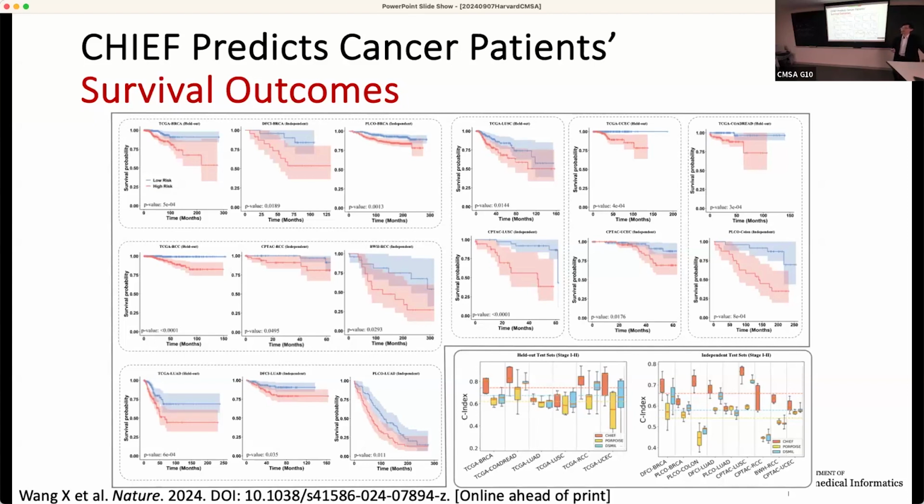That's another good point. In our paper, we didn't specifically predict the stage because the stage requires a holistic analysis of the extent of the tumor spread. For example, if the lung cancer tissue stays in the lung, it's usually stage 1 or 2. But if it has spread into any other parts of the body, to the liver, to the brain, it's by definition stage 4. That's information we have ready. Yeah, that's right.